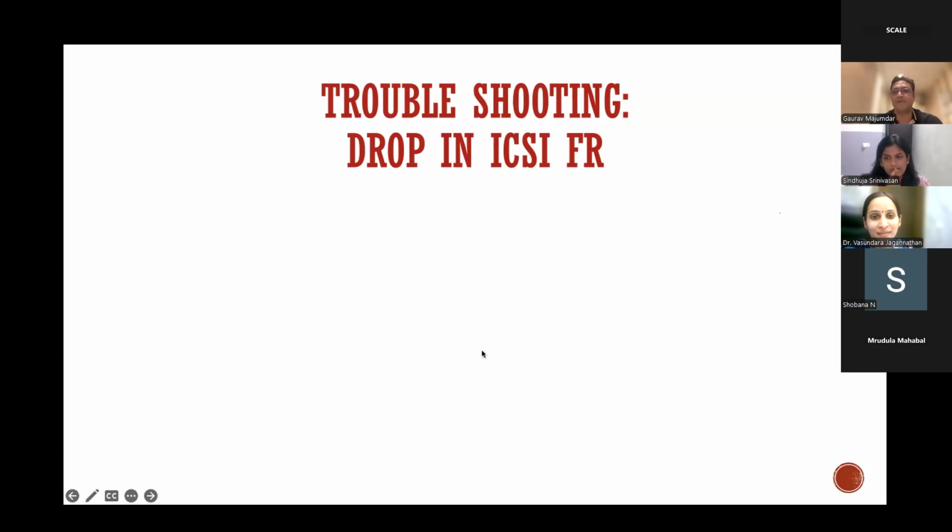When we start seeing a drop, and when I say a drop in ICSI fertilization rates, please understand that this is not individual cases. A drop means at the end of the month, after doing 50 cases or 100 cases, you calculate the overall fertilization rate and that goes down significantly. That is a drop. Please understand, it is not one patient where you got 20% fertilization and the other patient you got 80% fertilization, and then you start troubleshooting why patient A had 20% fertilization, right?